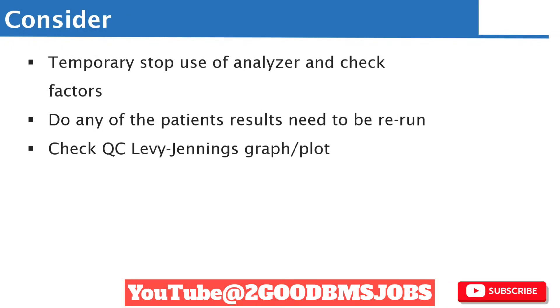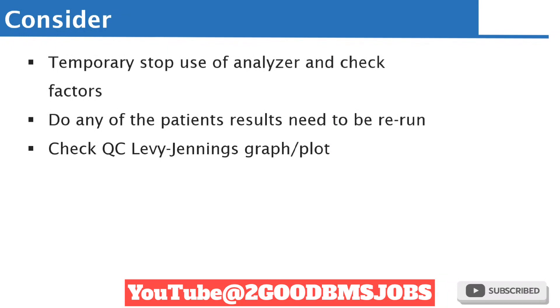In coagulation, maybe you run a quality control on PT, APTT, fibrinogen, or D-dimer. If a control failed on the normal plasma, you need to ask where did it fail — all parameters or just one? Similarly in biochemistry, you might measure alkaline phosphatase or total bilirubin. What exactly failed will determine the areas you investigate. That is why you need to check the Levey-Jennings graph.